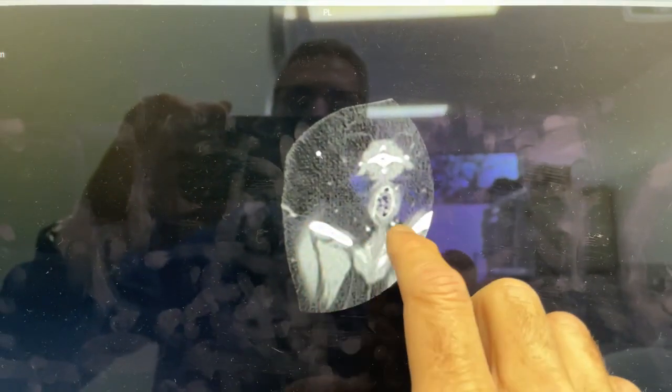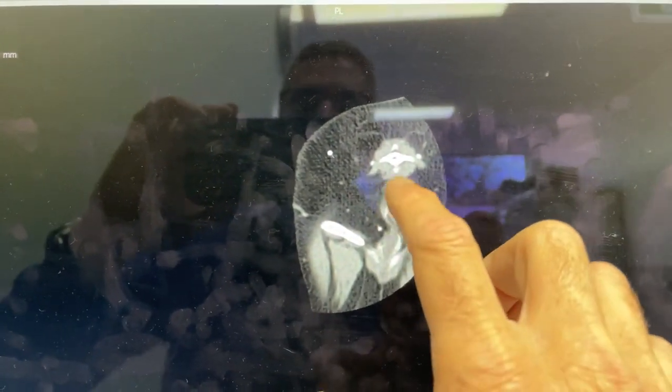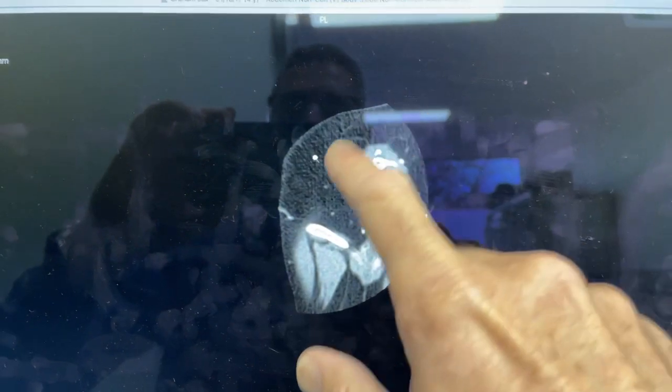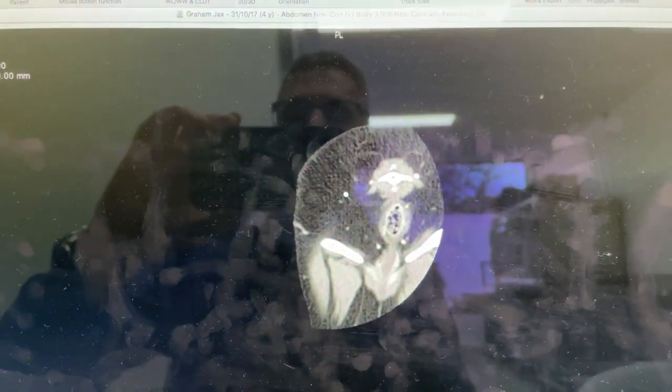So we can see here we've got the ischiatic tuberosities here and here. We have the colon and the tail here and then we've got just some subcutaneous fat up here.